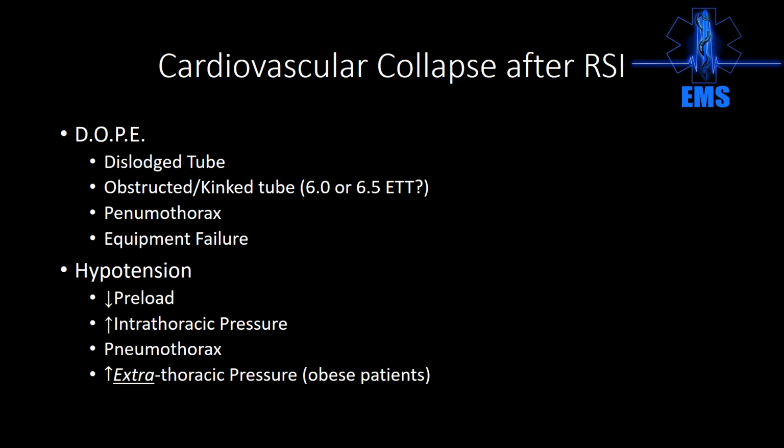So if you take the bag off and you squeeze the chest, you're going to hear this god-awful sound like eeeeee. And that is all the air escaping that has been trapped in the patient's lungs. That's happened to me a couple of times as well.